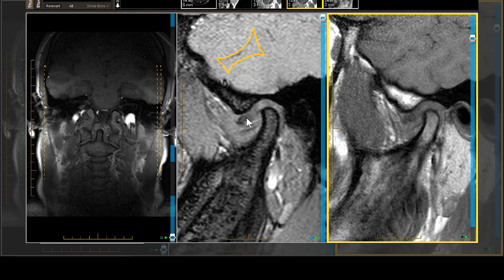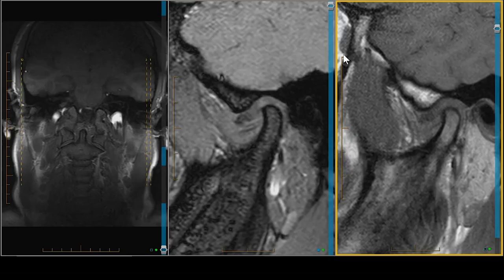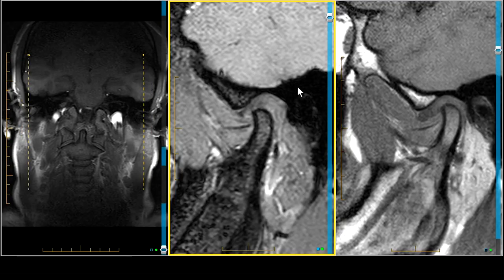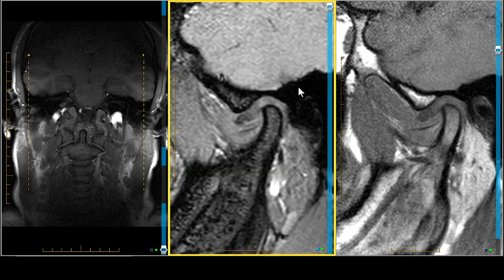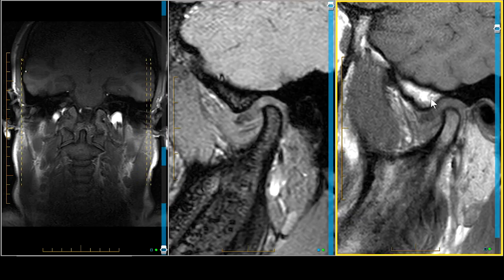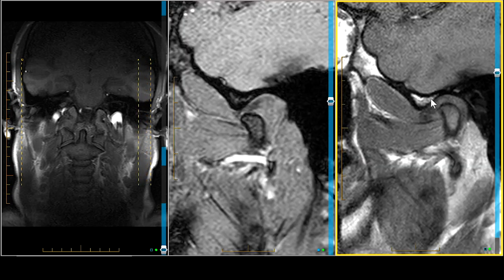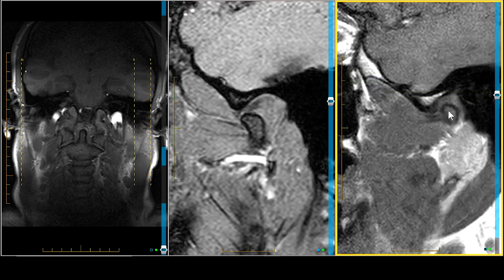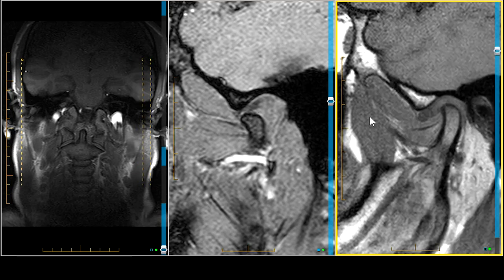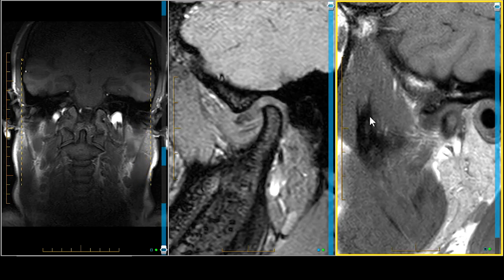The meniscus looks a little curvy or scrunched up instead of having this biconcave appearance. Another question you might ask is where are the attachments — we certainly don't see the lower attachment. So perhaps we ought to scroll a little bit on either side to identify the attachments. I'm going to scroll the T1 a little bit towards the medial aspect of the condyle — you can see where my line is moving — and then go back out laterally.